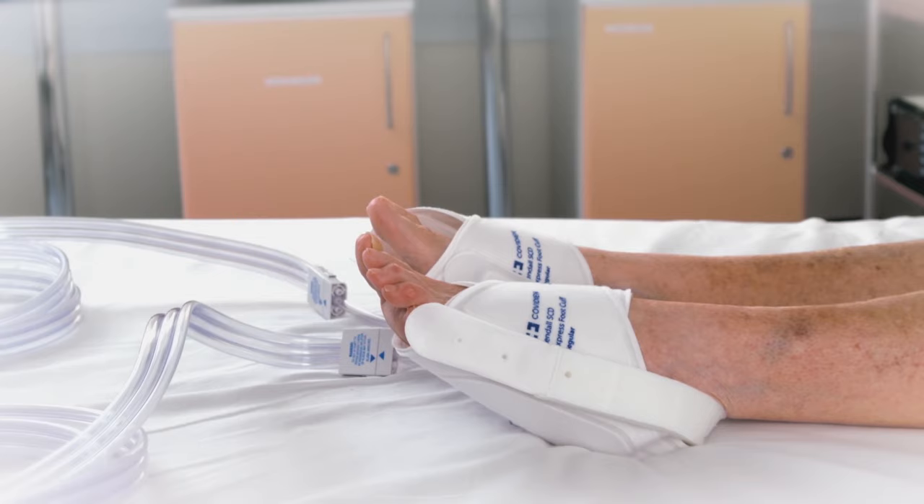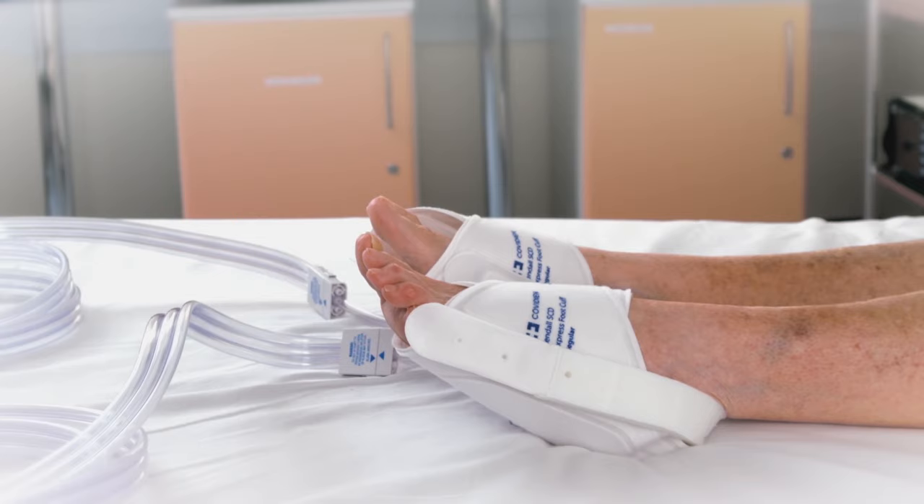This selection will be confirmed and foot compression will commence once a solid foot icon appears on screen.